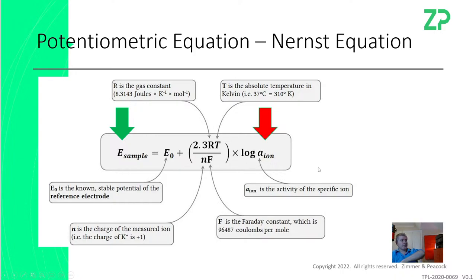And that's one of the benefits of electrochemistry, that a typical glucose strip may have a volume of 300 nanoliters. And so ion selective electrodes and electrochemical sensors can actually work on quite small volumes. And yes, volume is not part of the signal.